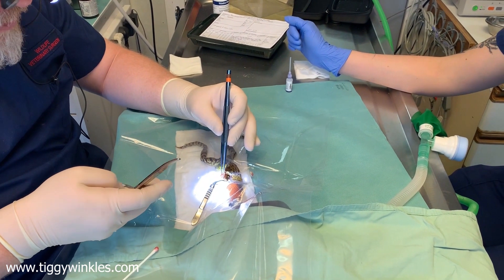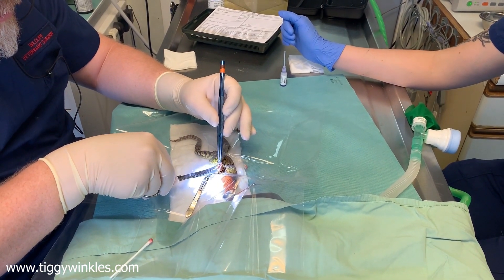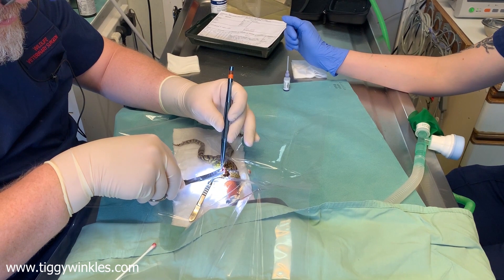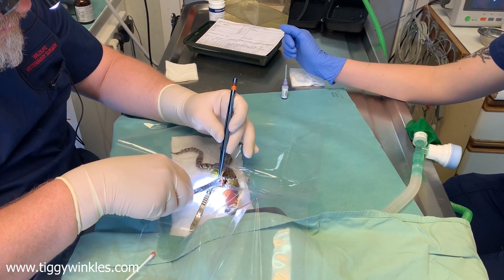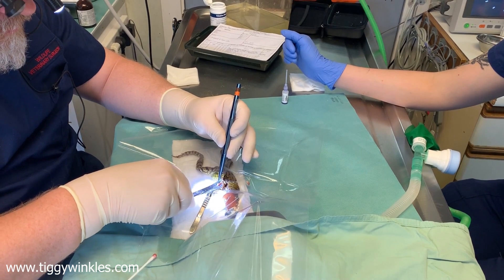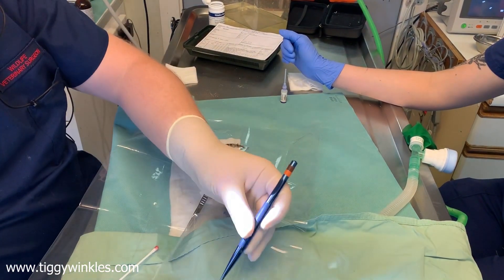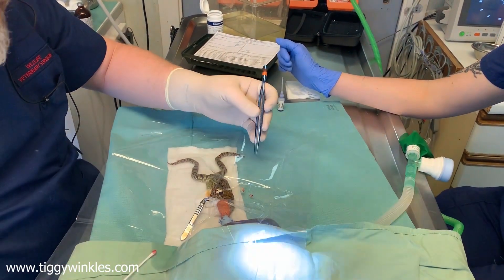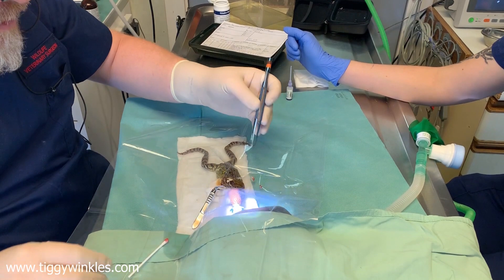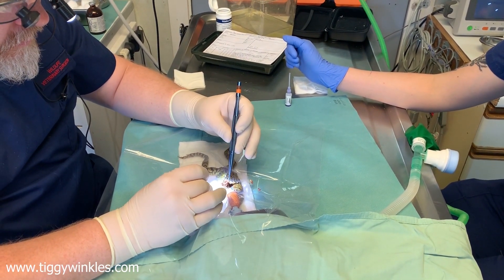We're going to use some scissors to trim that bone back. This isn't very pleasant, so look away if you're a bit squeamish. It's just the end of the bone — off. Doesn't look very big, but just to take that back. And now — yes, that's nice and tidy.